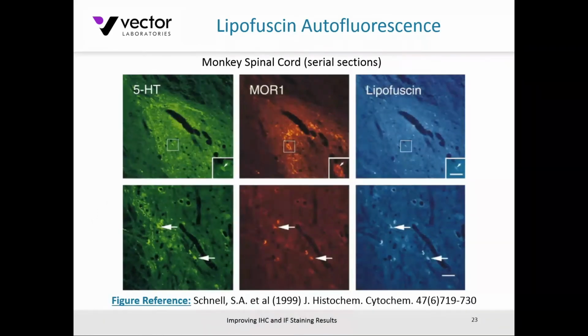There is another source of autofluorescence, I'll say, that investigators face due to something called lipofuscin. Lipofuscin is really an accumulation of proteins, lipids, etc., in predominantly CNS aged tissue, brain, spinal cord, things like that. And it has more of a punctate type appearance than what you see with the tissue elements I just showed before.